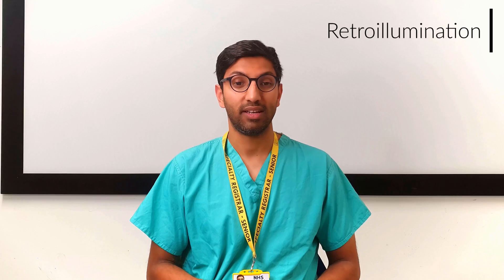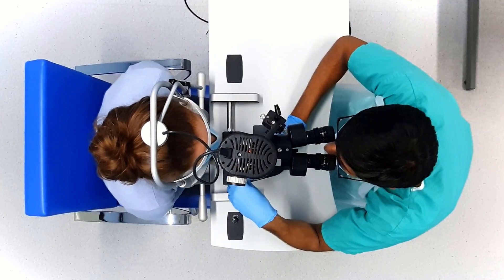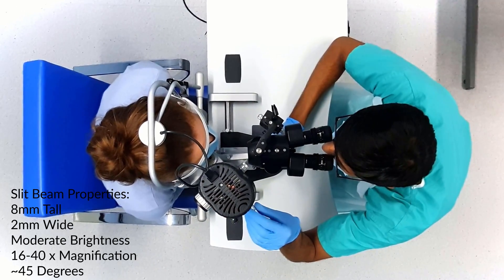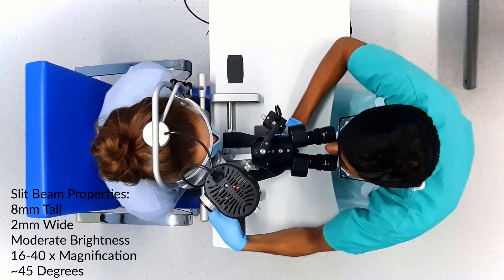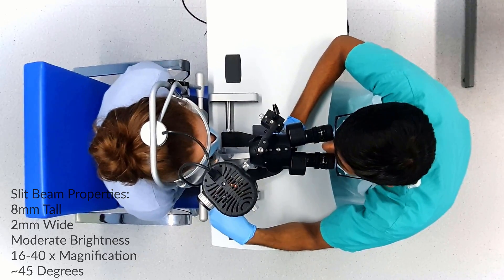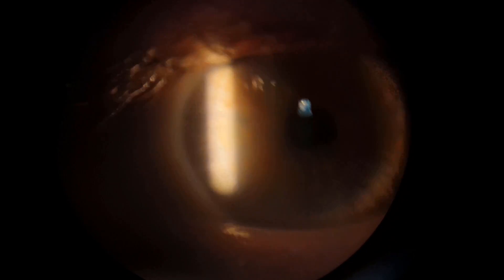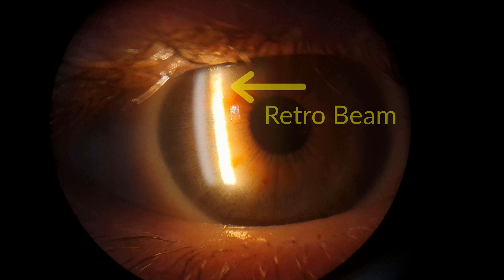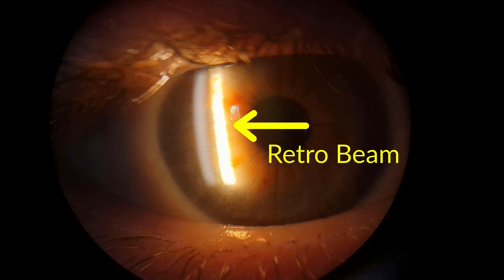Next is the retroillumination technique. It uses reflected light to illuminate other areas from behind. You can reflect light from the iris or the retina. To use the iris to retroilluminate, use a tall, moderately bright slit beam and angle the illumination arm. This can be helpful to detect fine corneal changes.